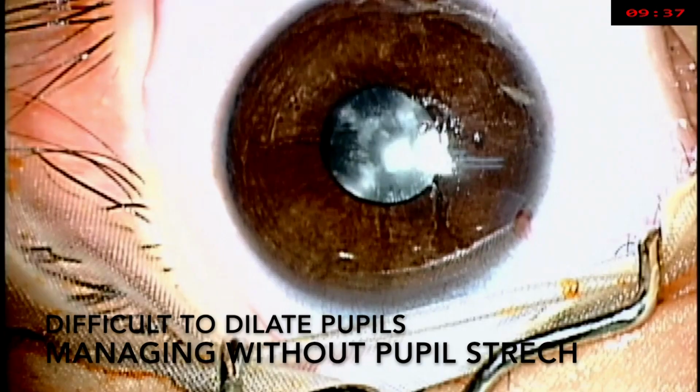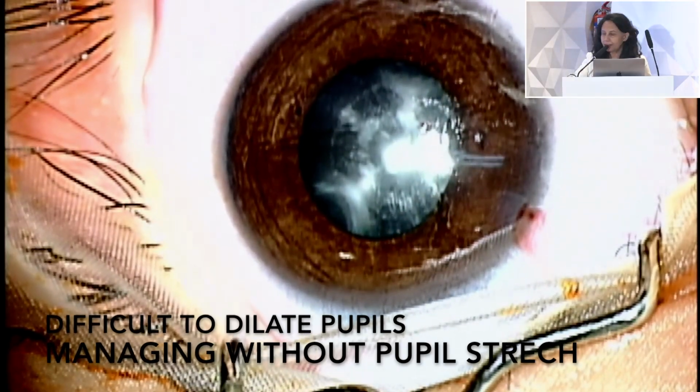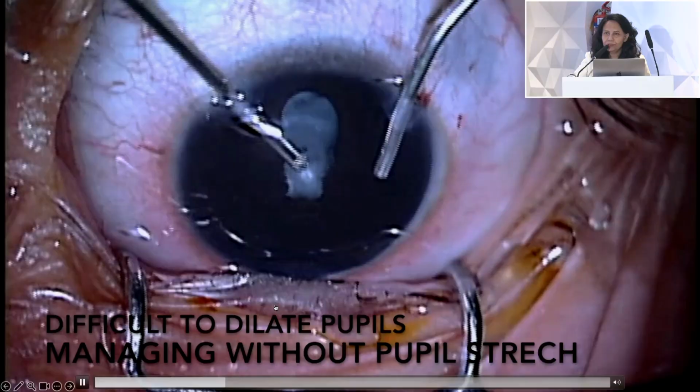I will show 3 clips of the pediatric cataract surgery videos, which I will just explain. This is the first one, in which I'm showing that without using the pupillary stretch, we can manage the pediatric cataract surgery in a small pupil. This is just an intracameral injection, which you can ask from your anesthetic colleague nearby and then put into that.